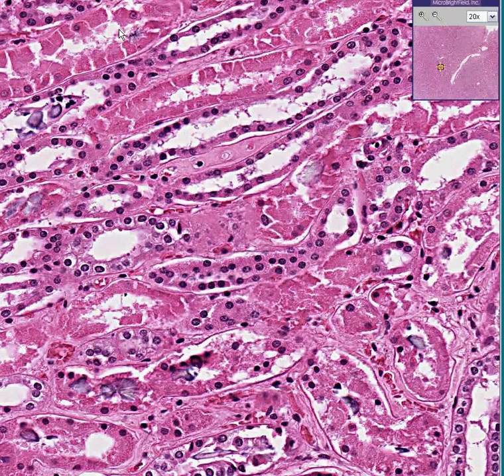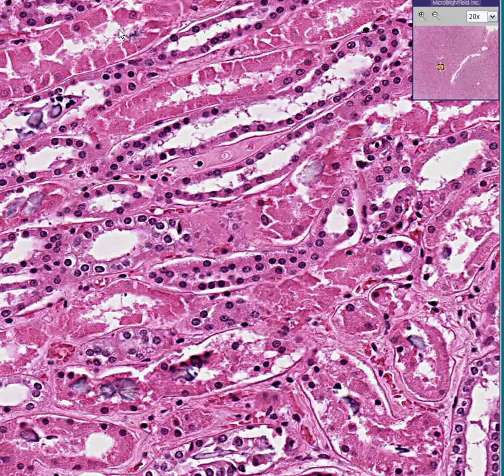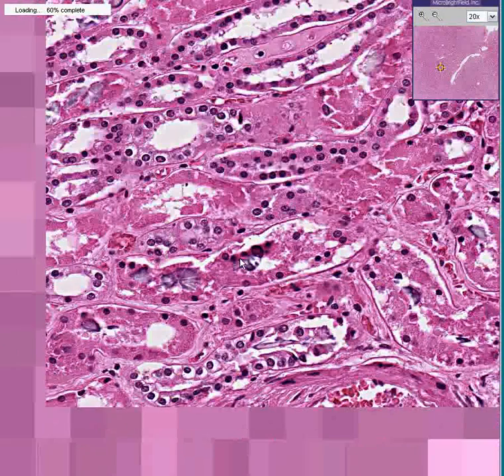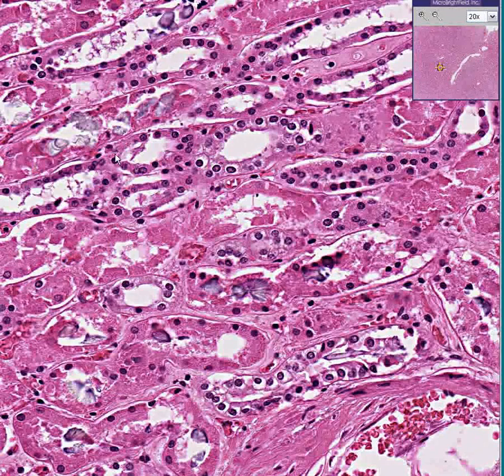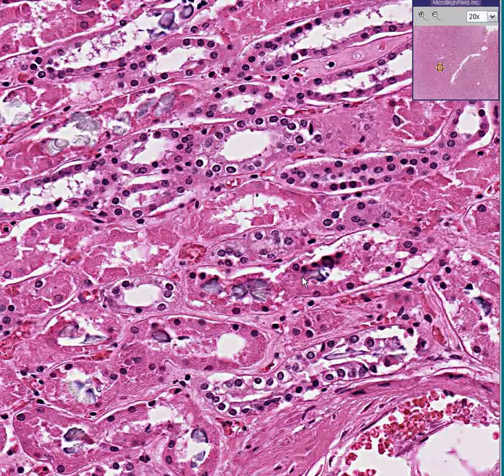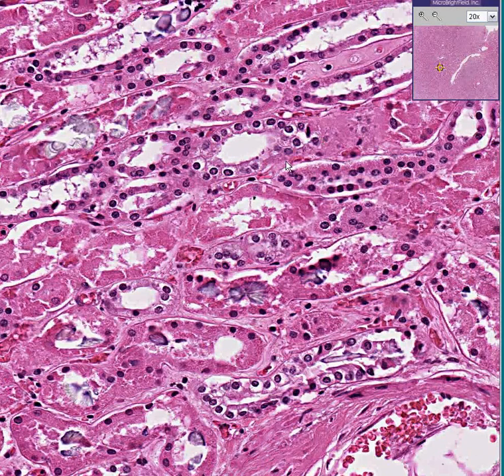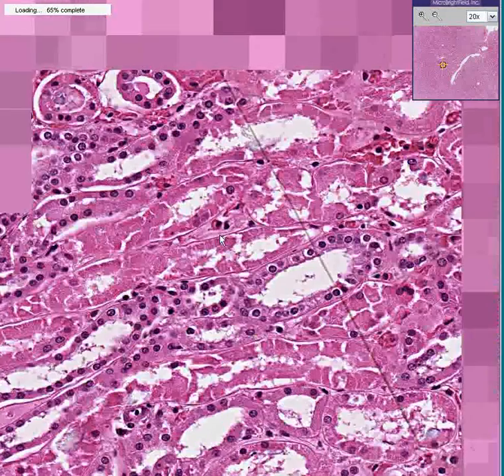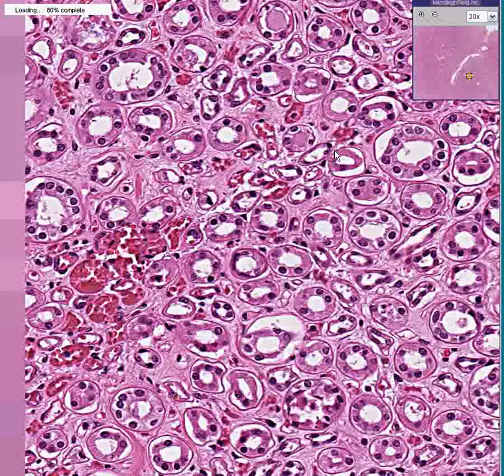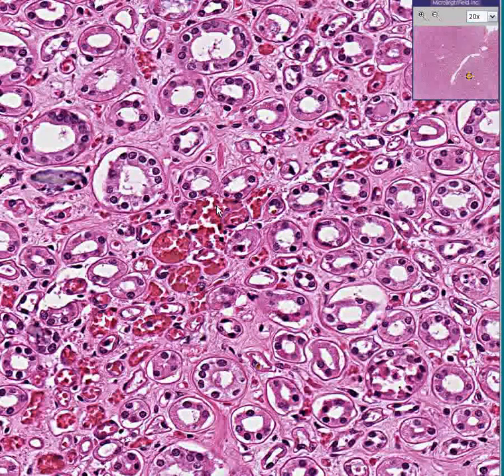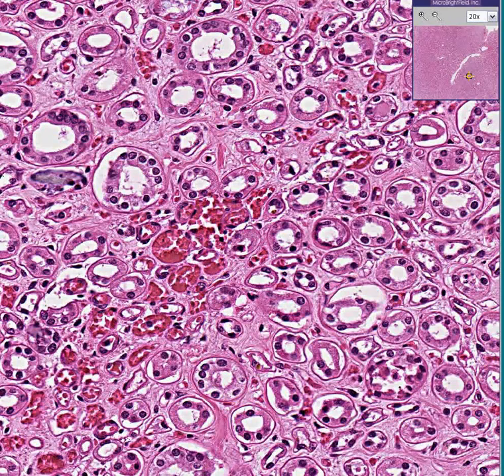Certain toxic compounds like ethylene glycol — antifreeze — besides wreaking severe havoc on multiple areas of the body, one thing it does is kill your tubules. And could this possibly be some crystallization of the compound? I would rather not guess because I don't know. But besides necrotic tubules in here, you see something else that doesn't look like it should be there. This is acute tubular necrosis — we can see it in the cortex near glomeruli, and also out in the medulla. In this case it is caused by ethylene glycol, causing acute tubular necrosis.